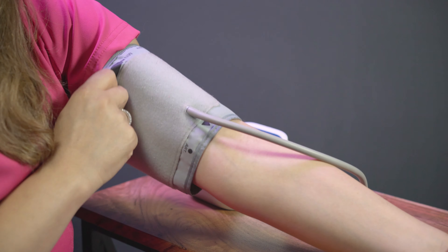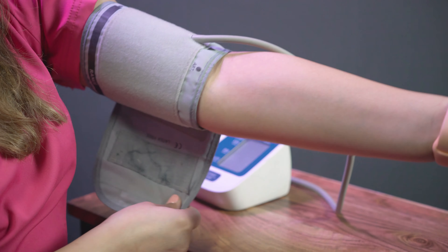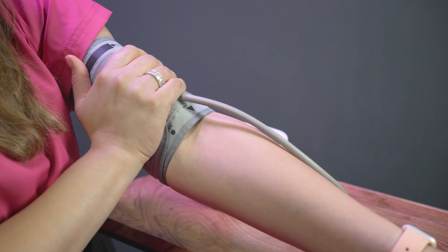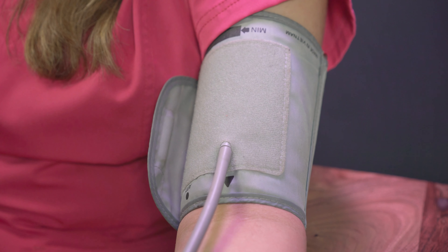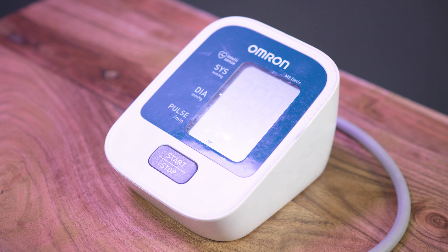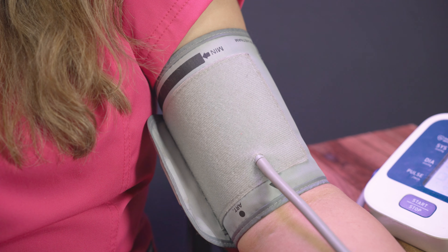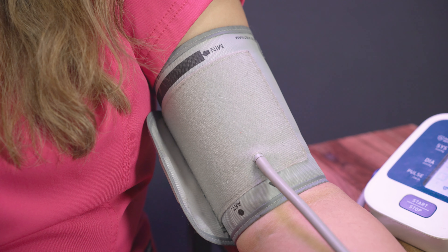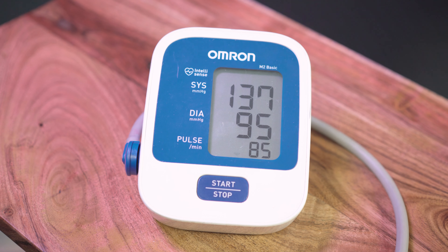Place the pressure cuff on your upper arm. Please avoid placing this on top of any clothes. The tubing or arrow indicator should be in the centre of the front of your arm. Start your machine and allow it to do all the work. Relax during the procedure, try not to talk and remain still. You will find the cuff becomes tight on your arm as it measures your blood pressure. Be reassured this will release.